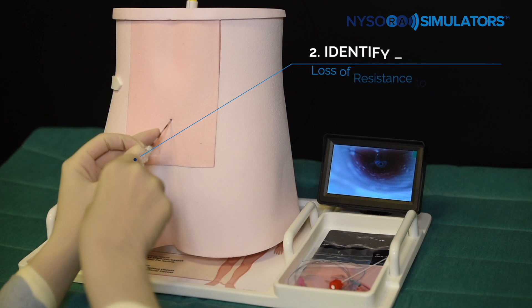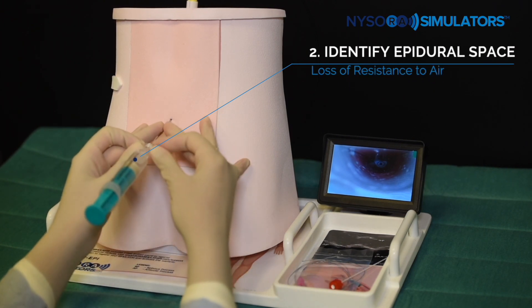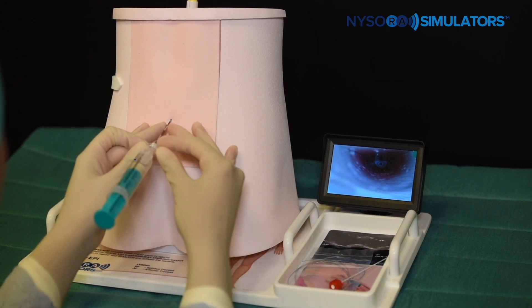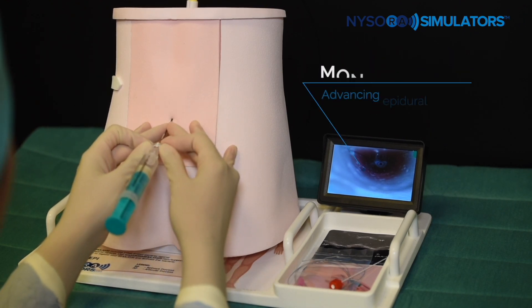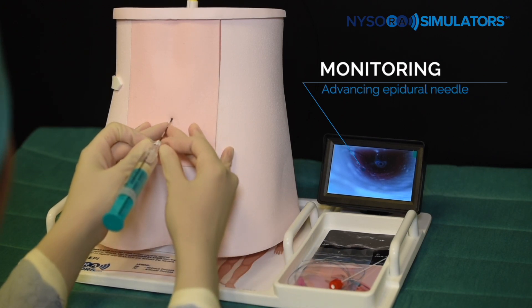To practice epidural analgesia, the needle is inserted in the interspace between L3 and L4 and advanced to enter the interspinous ligament. A syringe provided is attached to the needle and a loss of resistance to air is practiced in order to access the epidural space.